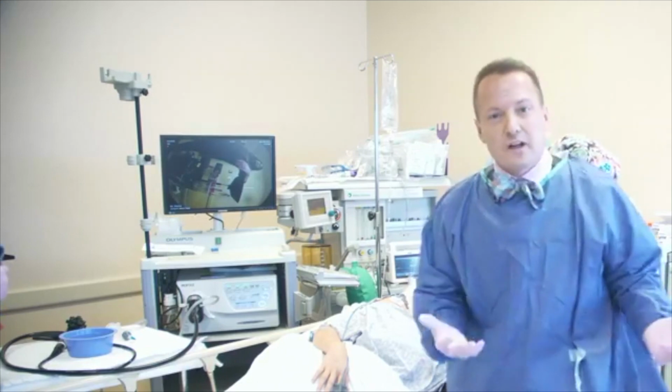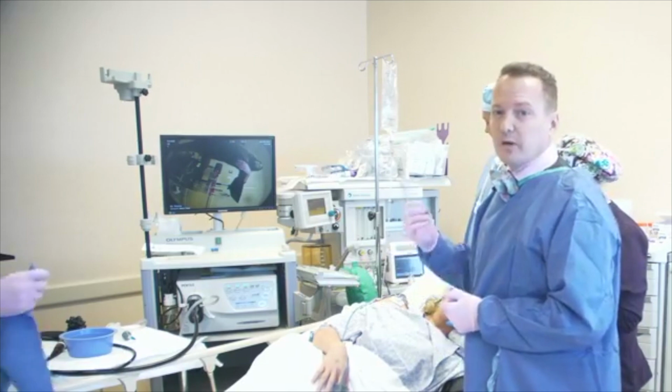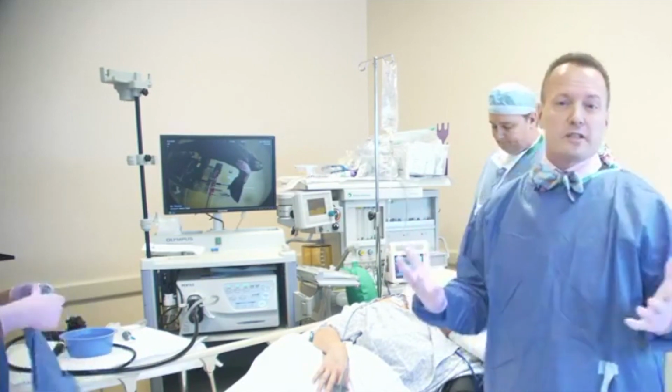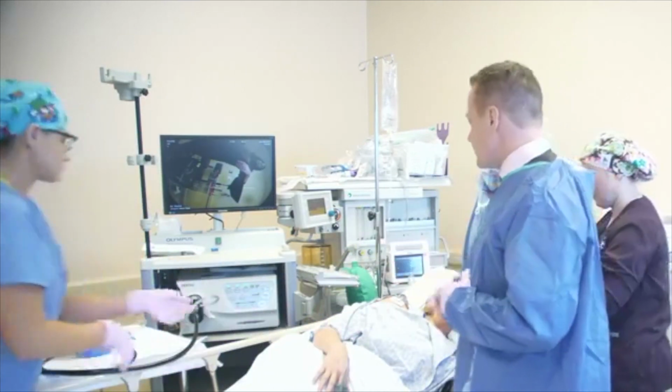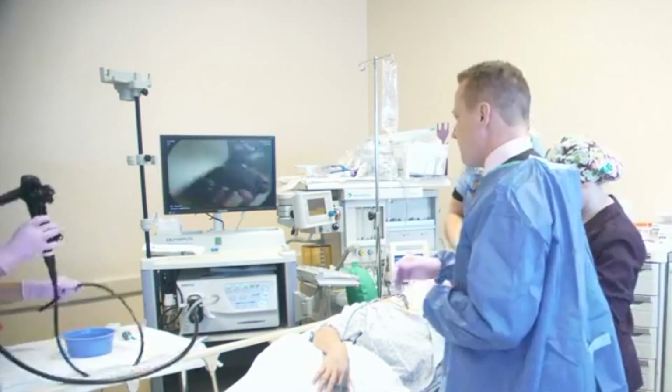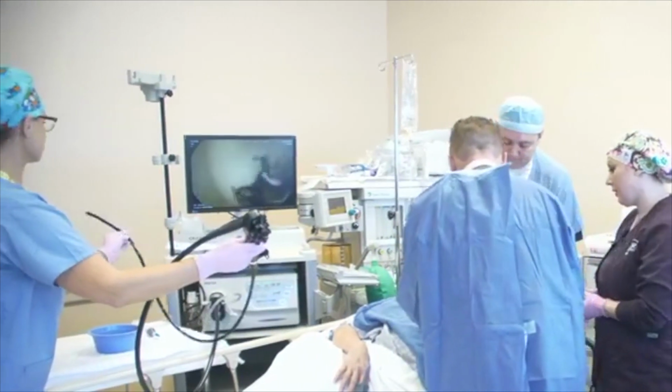Now, Shauna's already drifted off to sleep, so we're going to get started with our procedure. It starts basically with an endoscopy where we look down into her stomach, make sure the coast is clear, that there are no issues that would prevent us from doing the operation. So I'll take the scope now and the bite block, please. Bite block, scope. Okay. I'll be talking through it as we go.